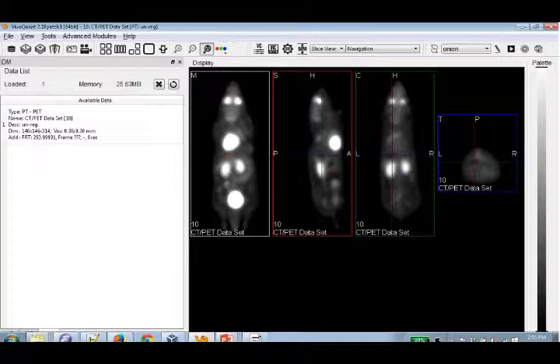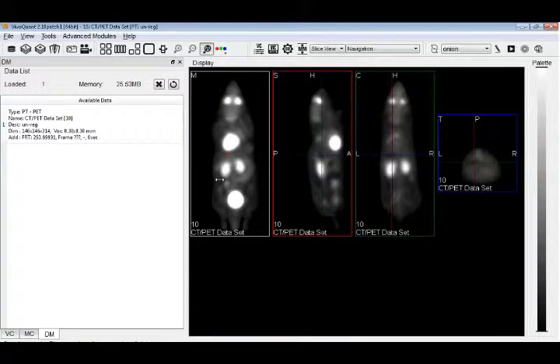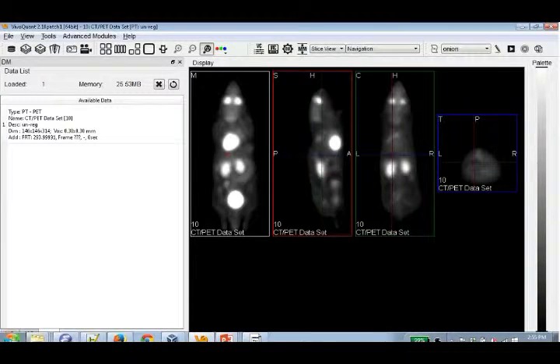You can save things back to the iPACS, either as an image, or you can save them in your web disk, just as simple files. Like you can save these QC PNGs in your web disk side and use them later, or have them be indexed or previewed with our nice iPACS 2.0 GUI, and many more. We've really done kind of everything that you can think of, at least at inviCRO, on VivoScript. It's typically the preferred way.